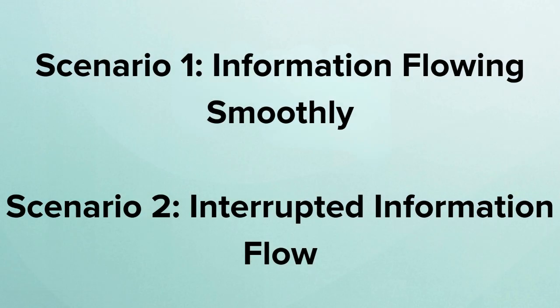Hey everybody, we're here at the HIMSS25 Interoperability Showcase where we're doing a demonstration station with our friends from Epic, BBraun, and InnoVision. And we're talking about point of care identity management today, which is designed to improve the overall workflow and association of device and patient information to aid in patient care delivery.